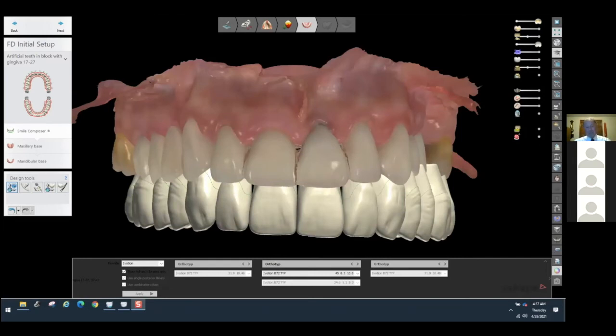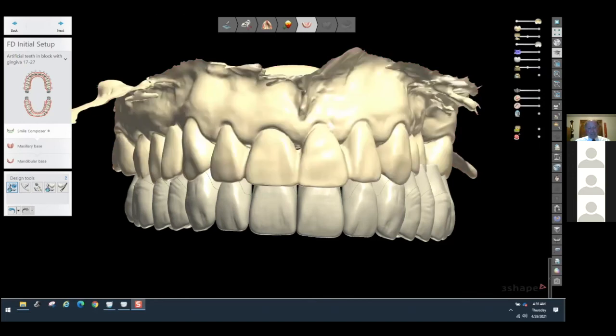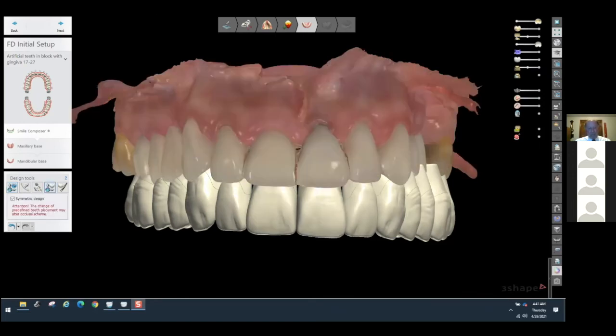Now this is another case I just started, and this is an intraoral scan for an immediate denture. So these are the patient's existing teeth. Same idea. This is a reference matrix. And again, I want to get in the ballpark, and I selected a tooth and size-wise, kind of in the ballpark. But now let's take this, and I could show different highlights. I kind of like the pink, a little bit better contrast here for me, so I stayed with that. And I'm doing another morphing here.